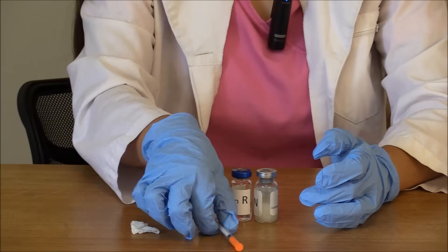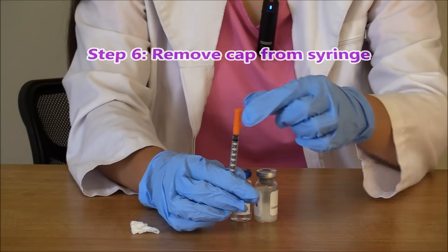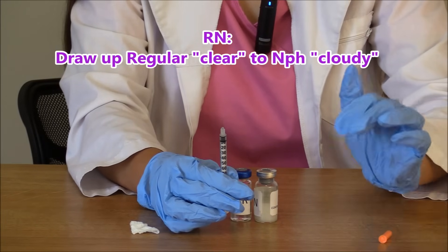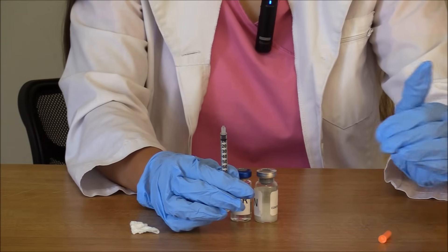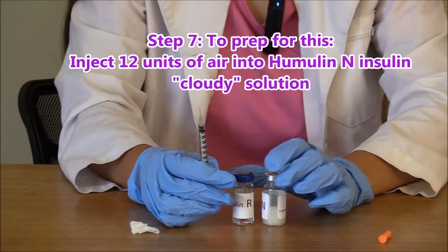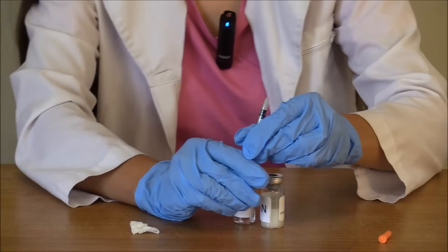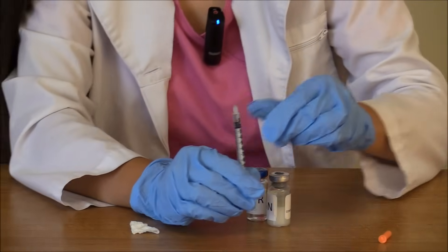Now we are ready to use our syringe. Take the cap off your syringe — remember the mnemonic RN — we're going to start with regular insulin and then go to cloudy. So it's clear to cloudy, regular to NPH. We are going to inject 12 units of air into our humulin N insulin. Pull back on your syringe to 12 units and inject that air into the vial.